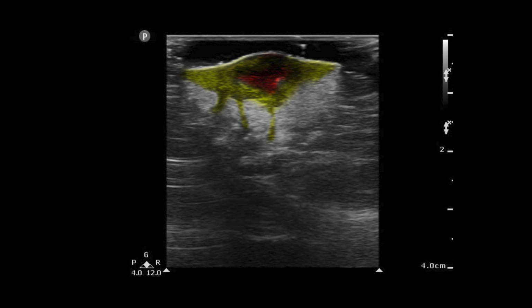Now, if you look in the zone surrounding that, we get back to that hypoechoic, more marbleized texture of normal tissue, right? I encourage you when you scan to scan above and below the lesion, including normal skin. This is what you're going to see. You're going to see that marbleized stuff turn into a thicker hyperechoic zone. And then if there's an abscess, you'll see more of that phlegmonous necrotic area in the center of that. And so that's going to be the anatomy of our abscess.